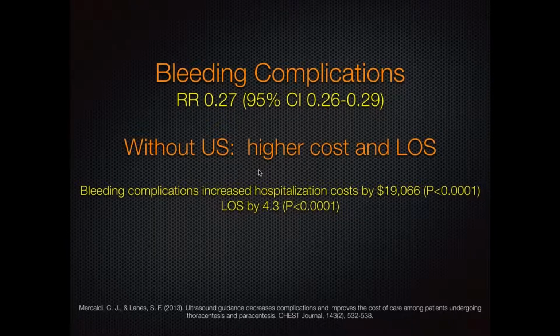So why am I going on about using ultrasound for paracentesis? We've all been doing paracentesis forever without using ultrasound. Complications aren't that great. There are studies that show that ultrasound, despite a low risk to start with, further decreases your bleeding complications.